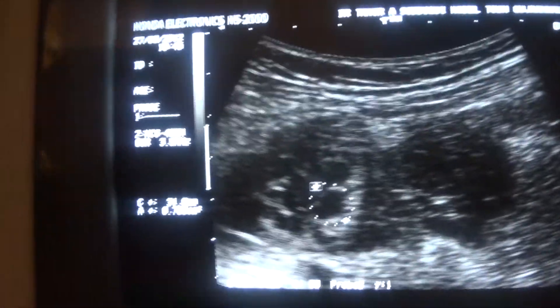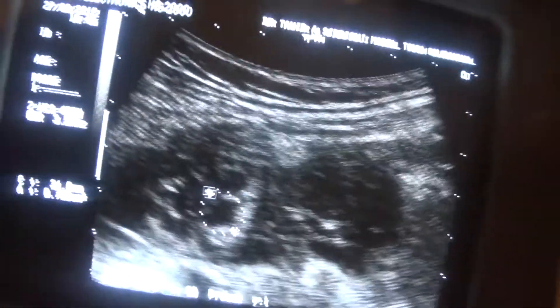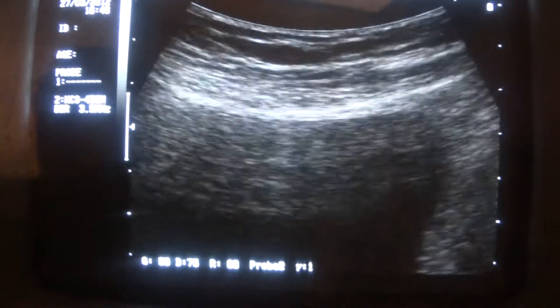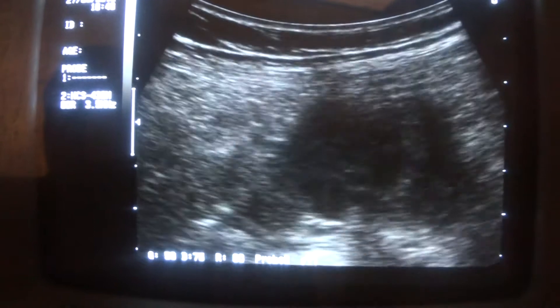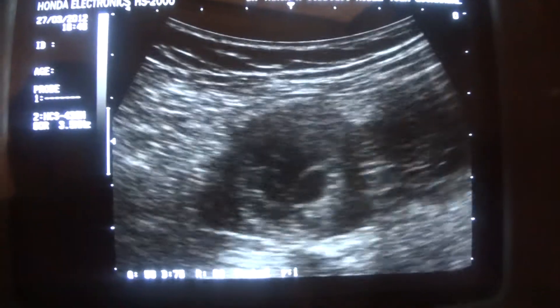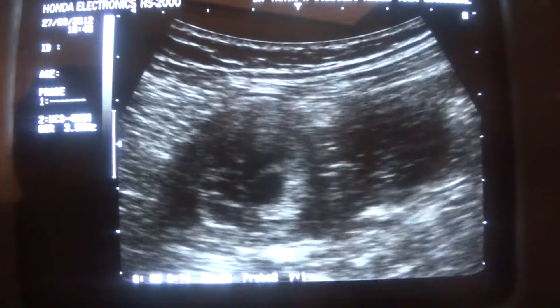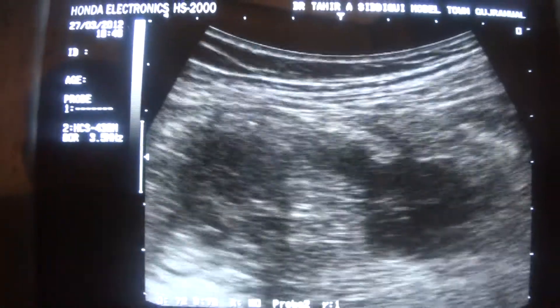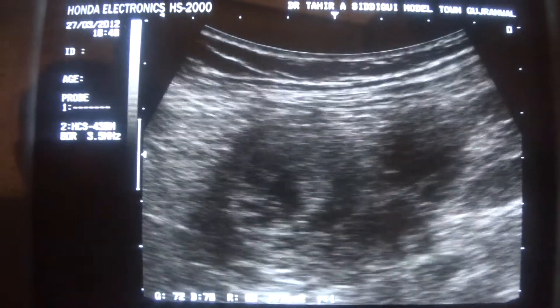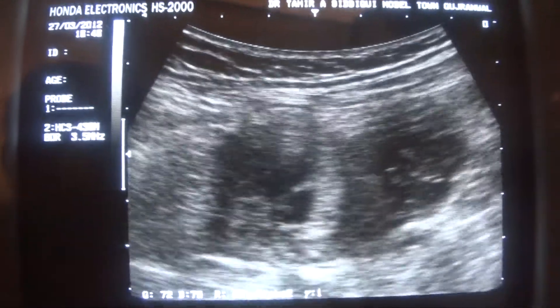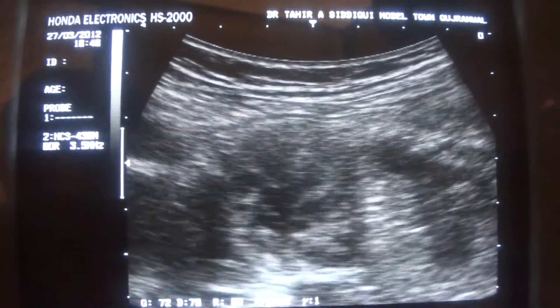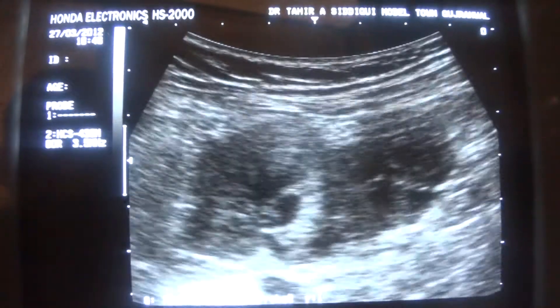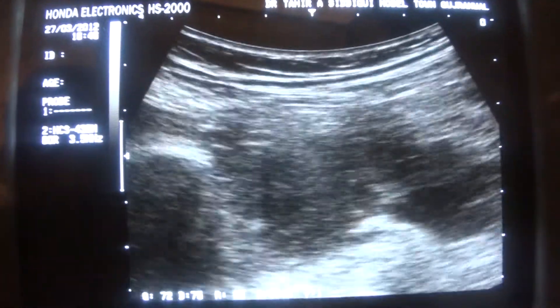This is all fluid with internal septations — these are all septations within this cystic area with an echogenic rim around it, which is most probably a gestational sac. And this sac is surrounded by fluid that contains a lot of tiny thread-like structures — septations.